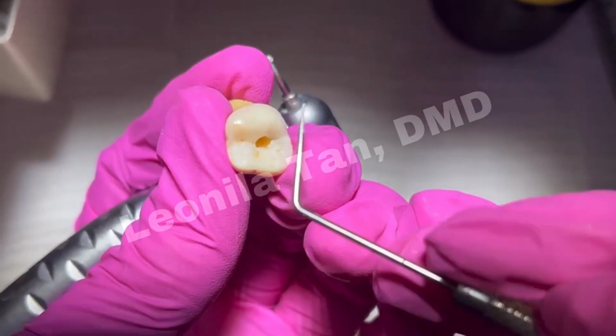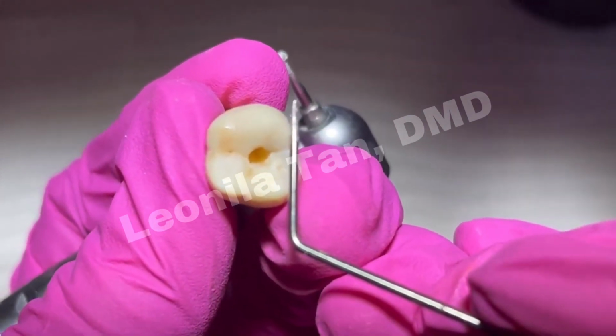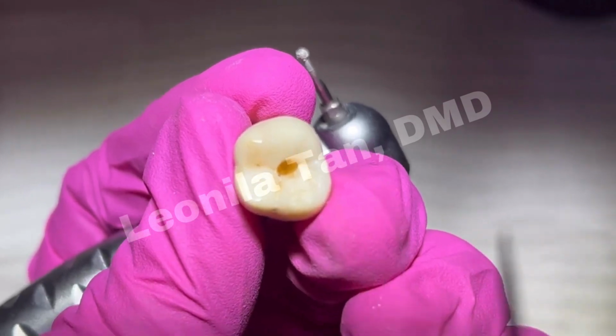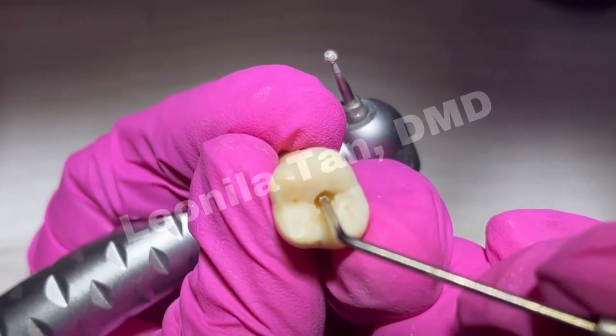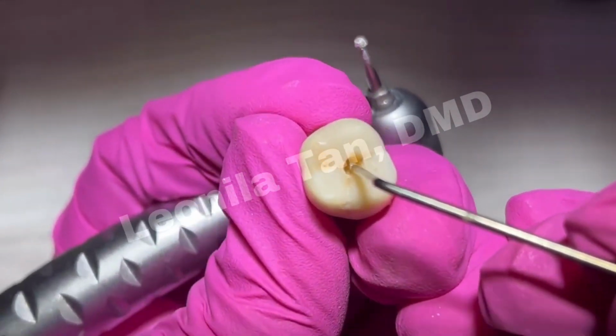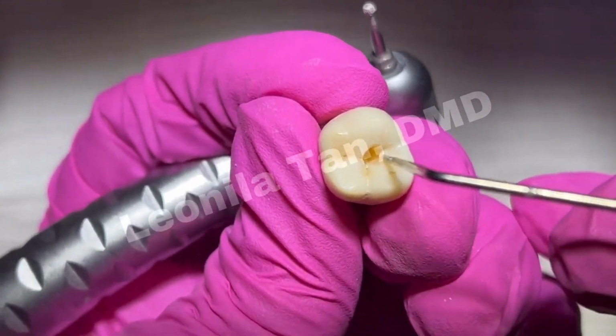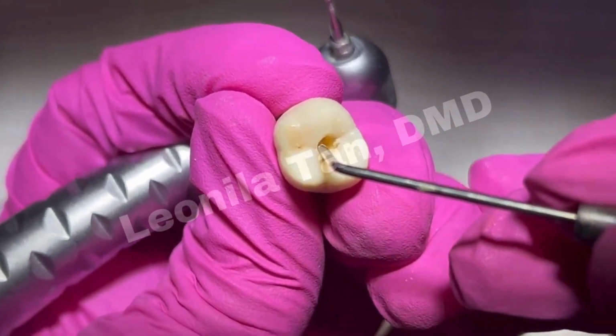Now, please remember, this is a multi-rooted tooth. You expect 3 or 4 canals, but you only enter or locate your chamber or drop into your chamber once. Please remember that.